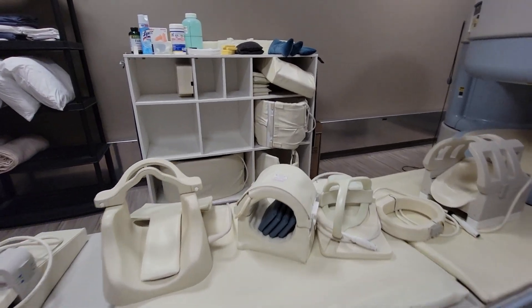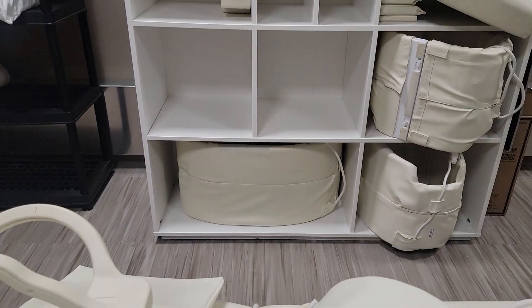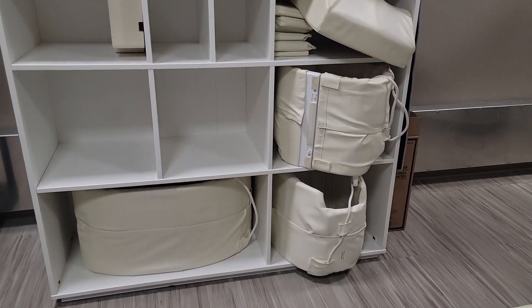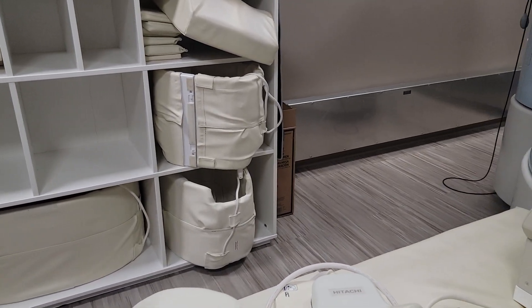We also have our body coils over there — that's a medium, large, and extra large — that wraps around the patient. It's used for abdominal work, pelvic work, long bones, again anything you can fit in there.